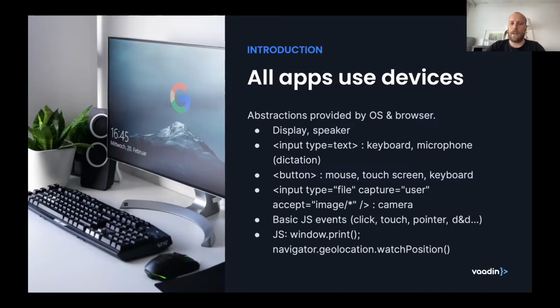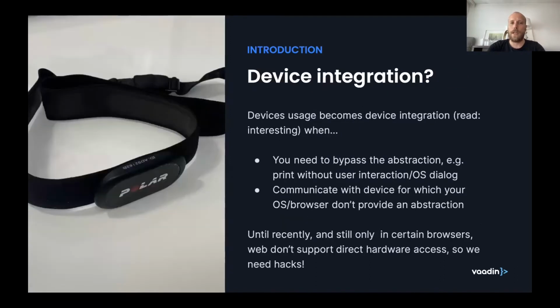But the difficulty actually comes when you have some kind of custom device, like this heart rate belt, that each and every browser just cannot provide an API for.